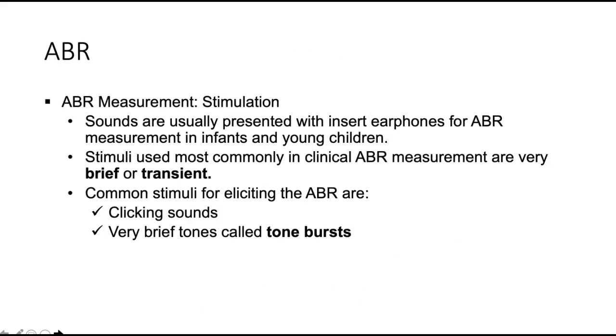We can use different types of sounds. We can use tones. We can use clicks. The main thing to remember is they're very brief or transient, okay? And we learned early on the effects of duration of the sound on the frequency content of the sound. And so there are some important considerations there, which are really beyond the scope of this course.